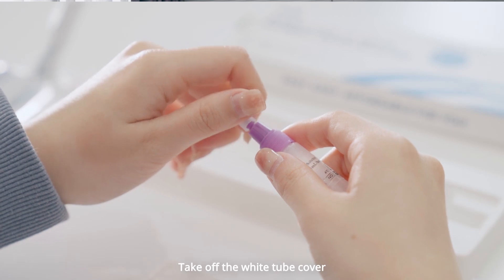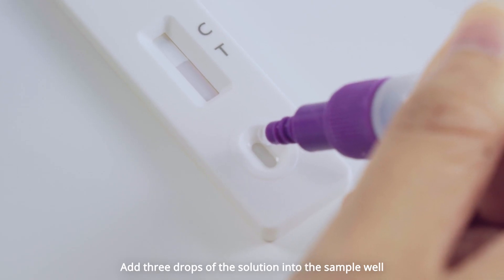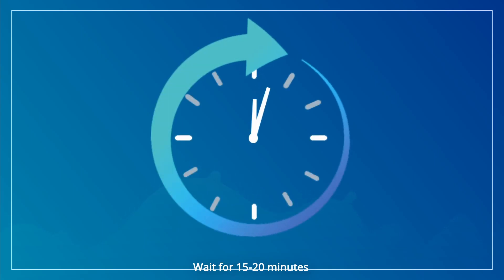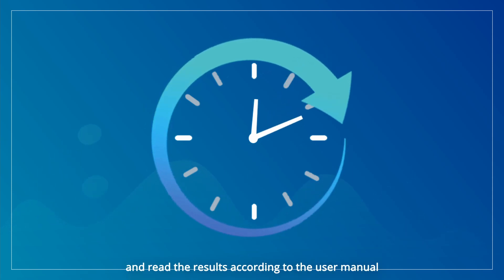Take off the tube cover. Add 3 drops of the solution to the sample well. Screw on the cap. Wait for 15 to 20 minutes and read the results according to the user manual.